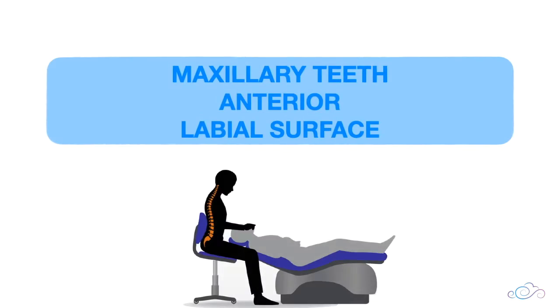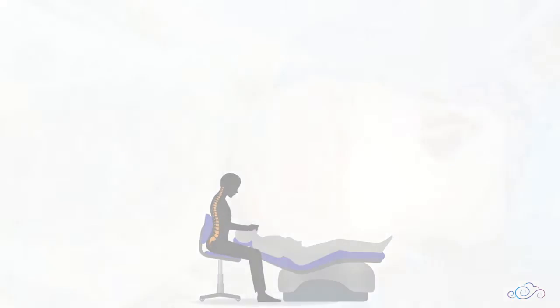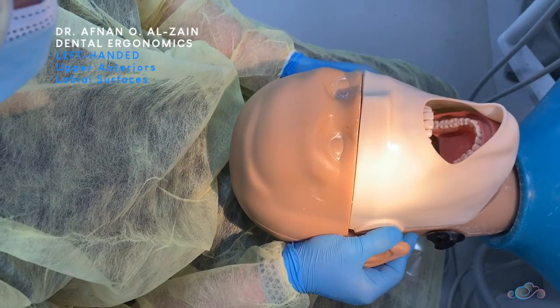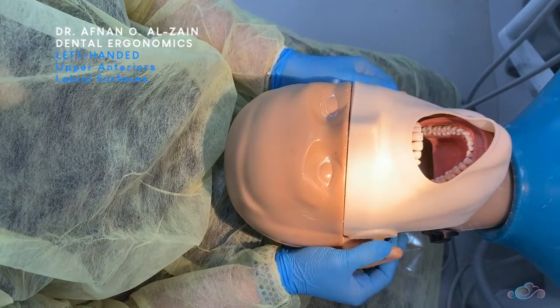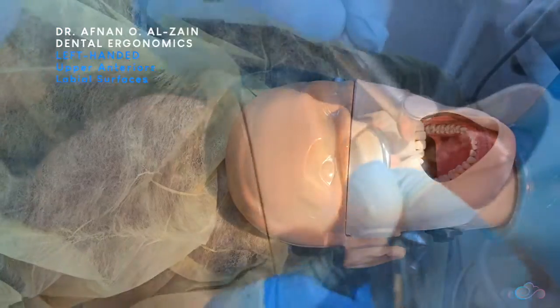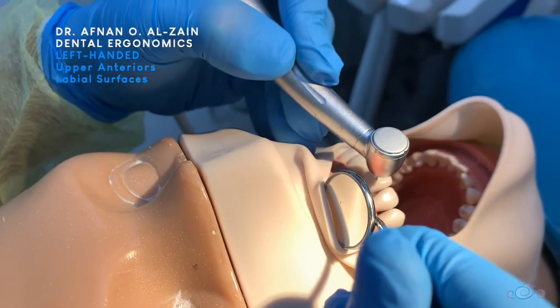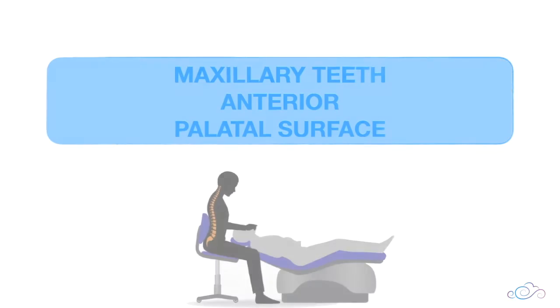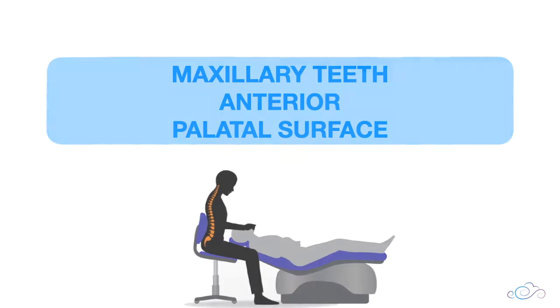Moving on to the labial surfaces of the anterior teeth. You're going to place the patient's head in a center position, sit behind the patient, place finger support, place the handpiece perpendicular to the surface, and look directly. For working on the palatal surfaces of the maxillary anterior teeth.